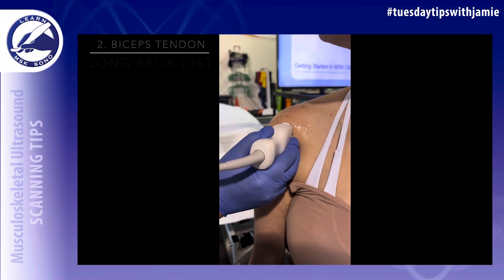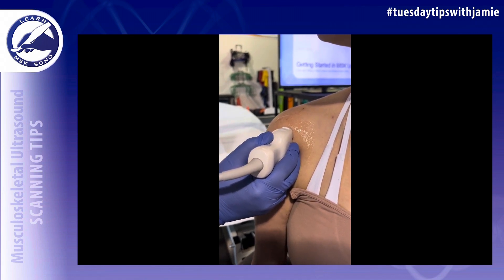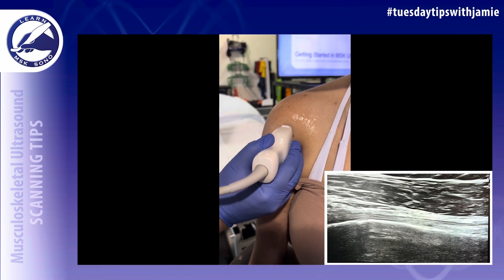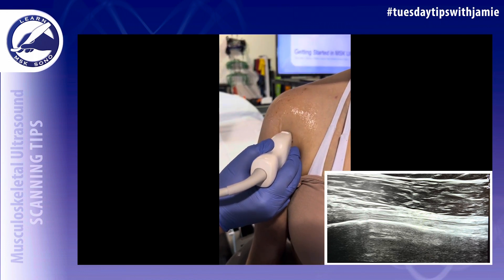Rotate the transducer 90 degrees to image the biceps tendon in the long axis from proximal to distal. As you scan distally, heel the probe down so that the tendon is straight across the screen, and scan until the myotendinous junction.